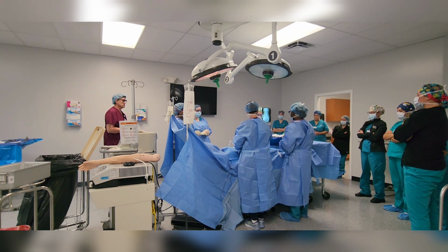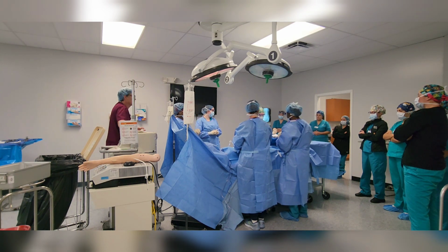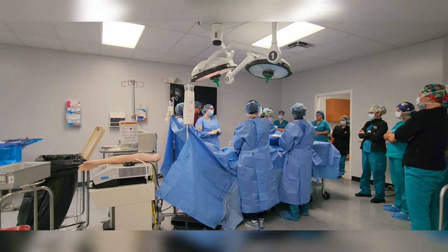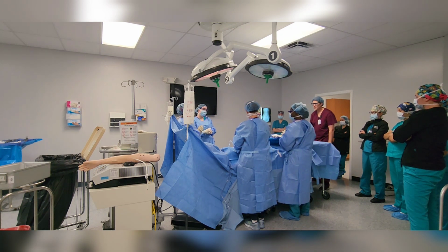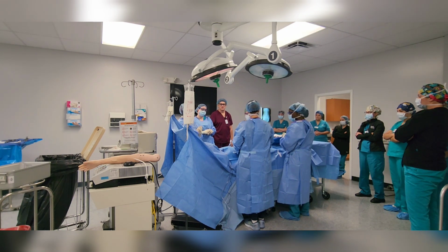What's the next thing? Forceps? Nope. What do you need next? You need tissue forceps. Where's your tissue forceps? So give me a DeBakey. Brooke, tissue forceps, my dear. On the tray. The tweezer. Yes, ma'am. There you go. Now they're going to hold it. Then you would hand the bovie because then they're going to make their incision a little bit deeper.